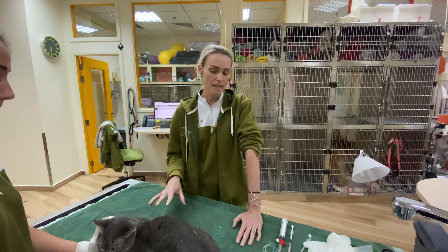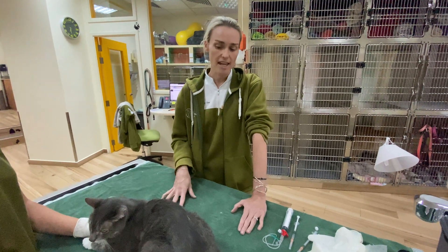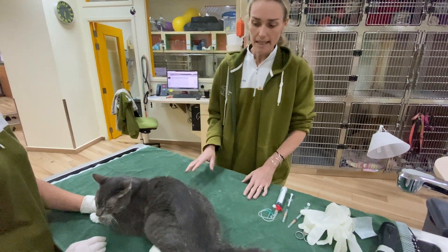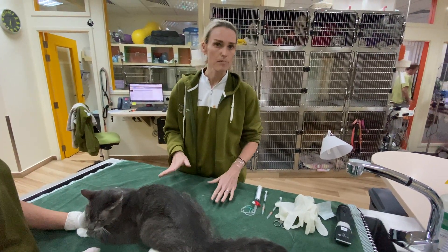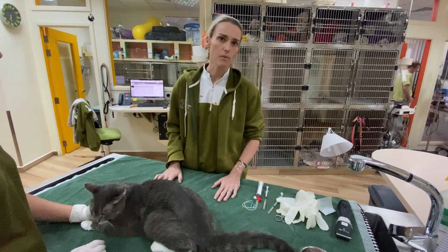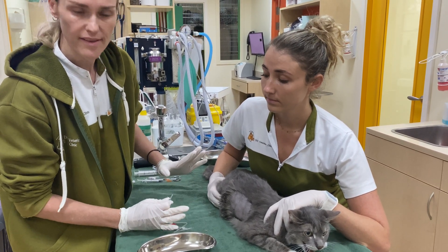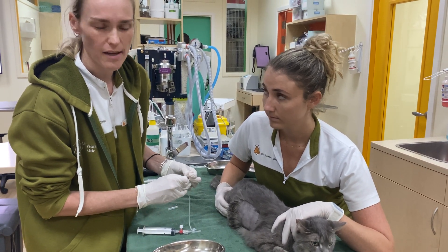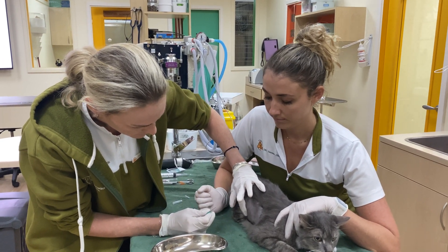He's actually coping very well in between, and thankfully he's a very good patient — we can do this procedure and he manages well without needing sedation or anything like that. At the moment we're prepping him and we'll be applying a little bit of local anaesthetic to the area behind his ribs, so he should feel a little less sore, and we'll be going in to see if we can get some fluid out of his chest.